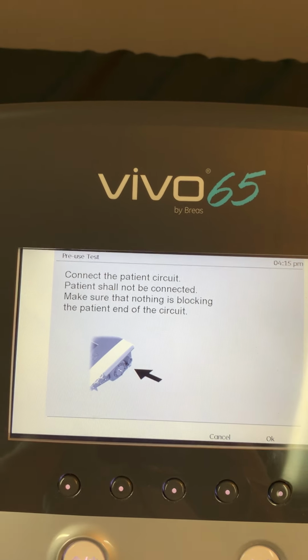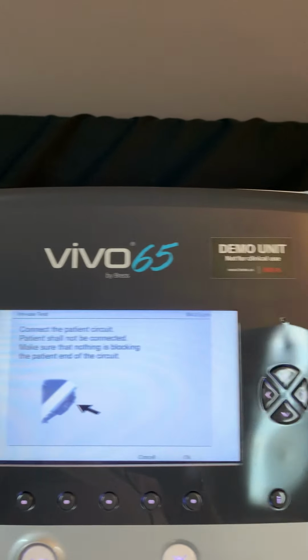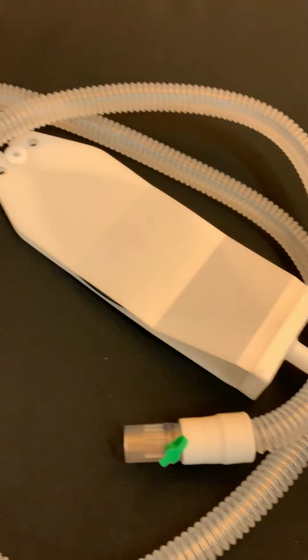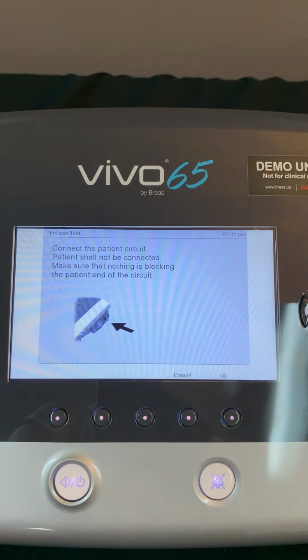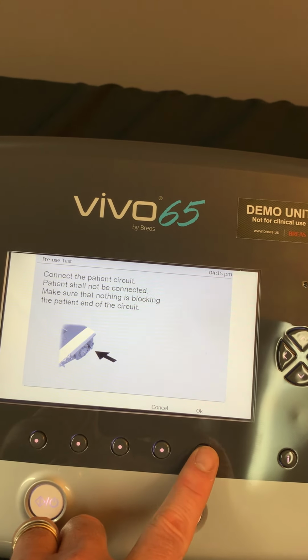So the first thing is that you want to connect the patient circuit to the device, and as you can see, I've already done that. The patient shall not be connected, which they are not, and then you want to make sure that nothing's blocking the end of the circuit. So I'm going to go ahead and click that OK button.